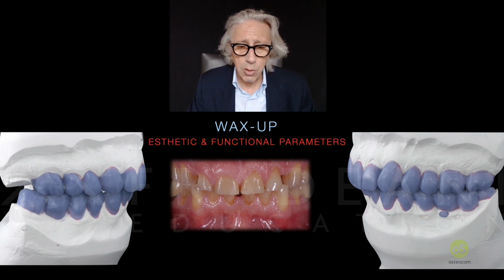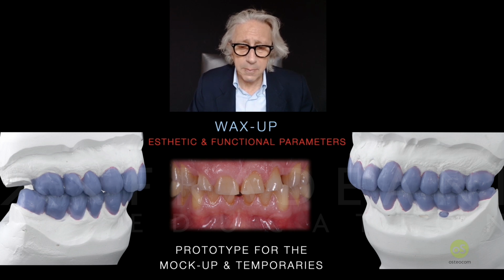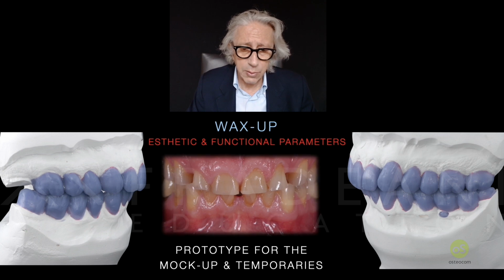So let me show. We have put all the aesthetic and functional parameters inside. Now, the wax-up at first, the mock-up at second, and the temporary third, will become a prototype for the final restorations.